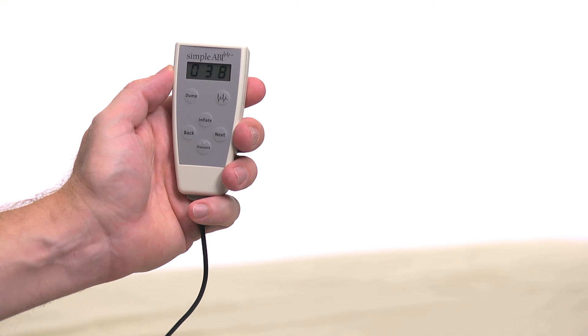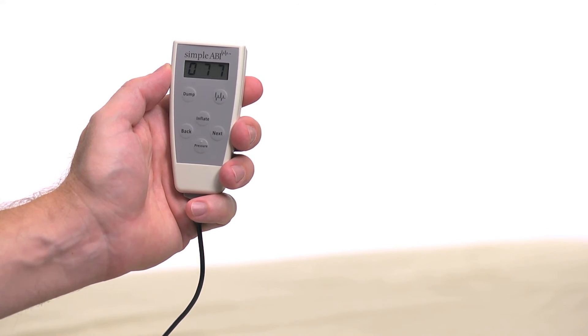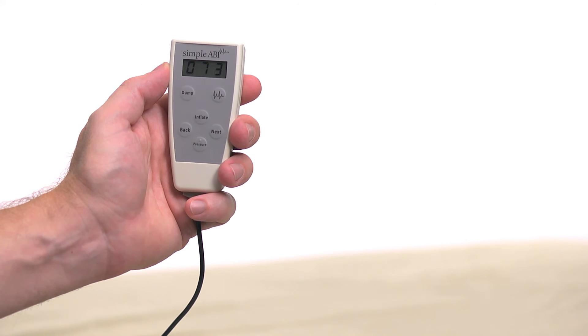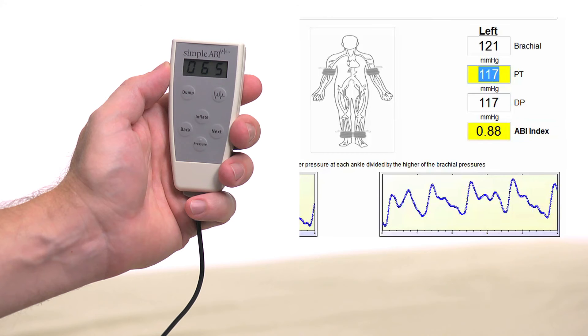To obtain a PVR waveform at the ankle cuff, press the button with the waveform image on the remote. The cuff will inflate to the proper pressure and hold while the waveform is obtained. Five seconds of waveform data is captured after the cuff pressure stabilizes at 65 millimeters. The patient should remain still during the measurement. You can repeat the measurement by pressing the waveform button again. When satisfied, press Next to move to the next site.